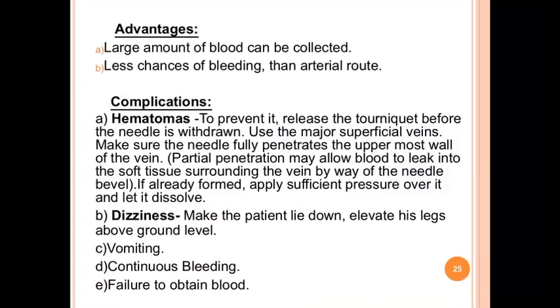The advantage of venipuncture is we can collect a large amount of blood and there is less chance of bleeding than with the arterial route.